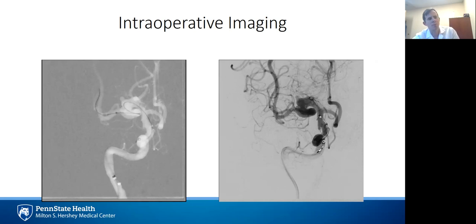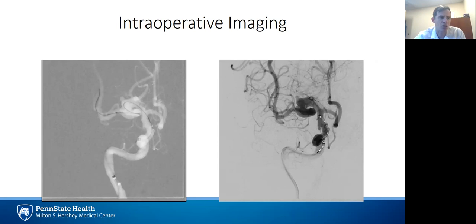In this case, we used the Pipeline Flex device. The first flow diverter placed retracted slightly proximal to the second excrescence we were trying to cover, and a second flow diverter was placed. When placing multiple devices, it is important not to undersize subsequent devices, as this may lead to poor wall apposition, resulting in parent vessel stenosis or thrombosis, or failure of the aneurysm to occlude.